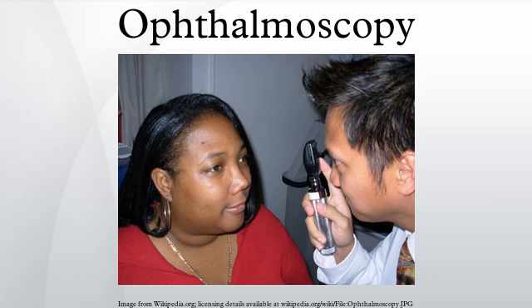Indications: ophthalmoscopy is done as part of a routine physical or complete eye examination. It is used to detect and evaluate symptoms of various retinal vascular diseases or eye diseases such as glaucoma. In patients with headaches, the finding of swollen optic discs, or papilledema, on ophthalmoscopy is a key sign, as this indicates raised intracranial pressure which could be due to hydrocephalus, benign intracranial hypertension or brain tumor, amongst other conditions. Cupped optic discs are seen in glaucoma.